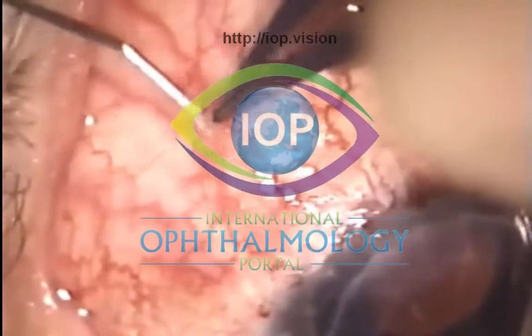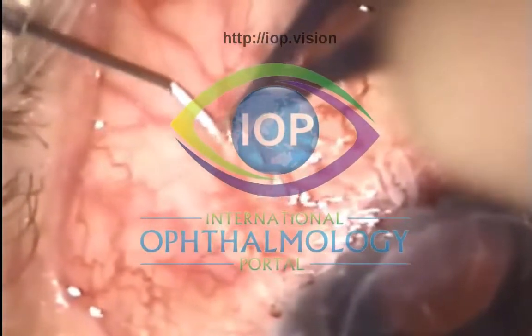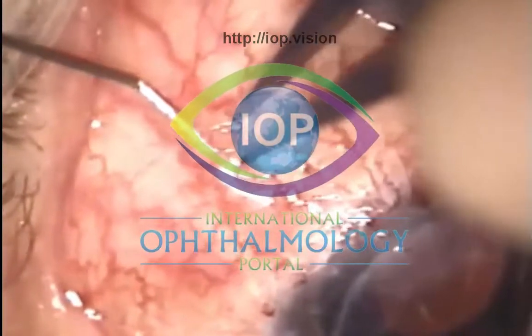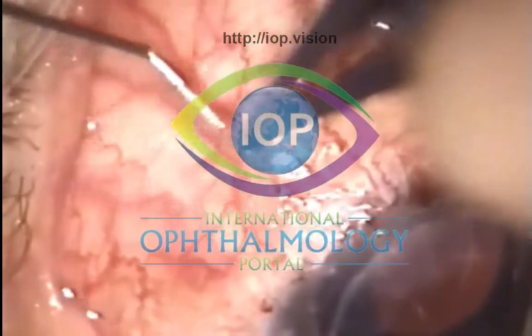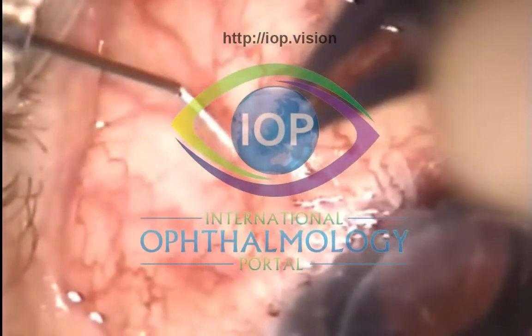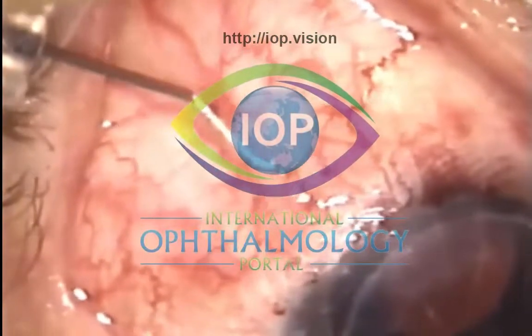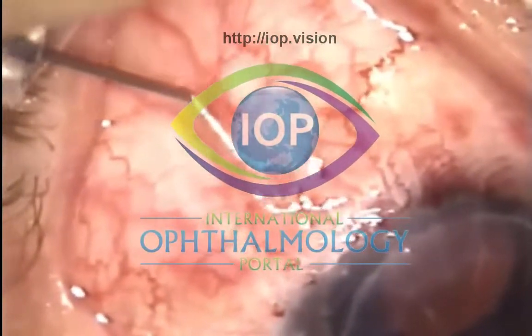As you know, redo trabeculectomy in this kind of eye is going to be very difficult. Tube is fraught with the difficulty of graft failure, and so the idea was that if I could resurrect this bleb, it may save the patient having further surgery.